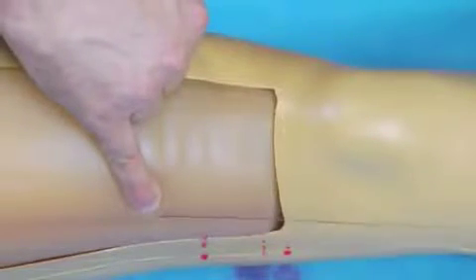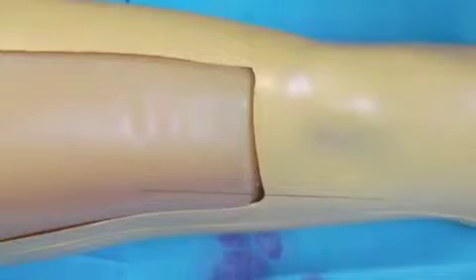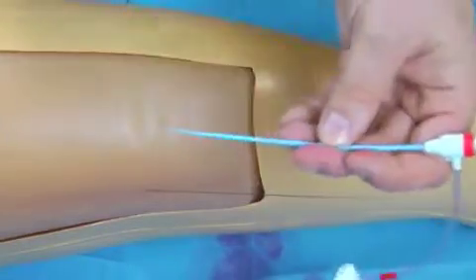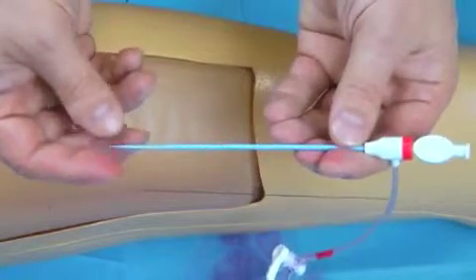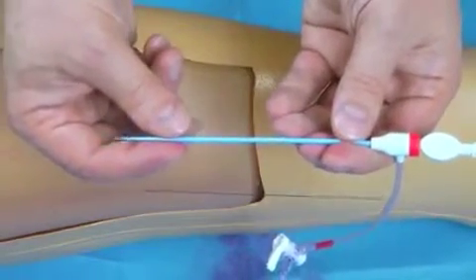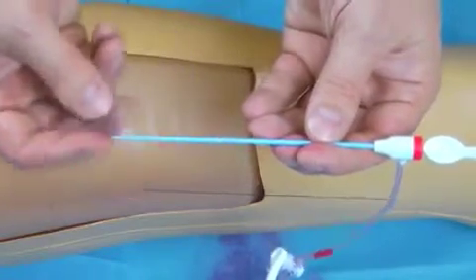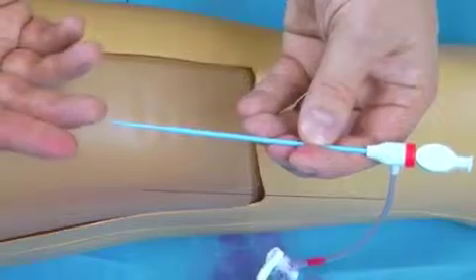And you can see a tiny, tiny little hole here, which in the real patient would be really tiny access. Once the guide wire is in place, we can then put the introducer in, and this is the Never Touch Direct introducer, which is very, very small. It's beautifully tapered, so as it goes through the skin it will just dilate the skin, making a very small passage, and at the end you won't even need a suture at all. A little steristrip will be enough to close the wound.